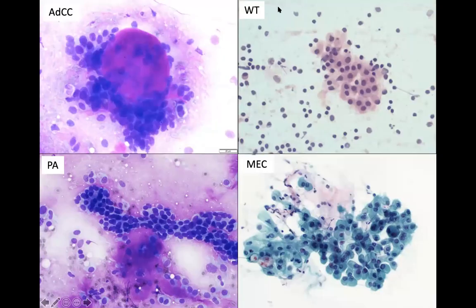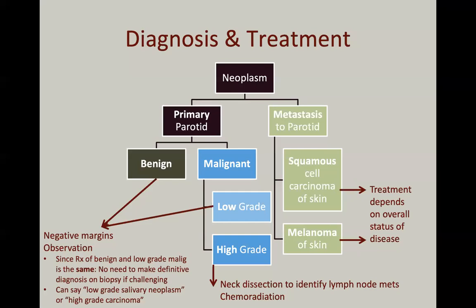Here are some examples of what might actually be diagnosable as neoplastic, ranging anywhere from adenoid cystic with this classic so-called bubblegum colloid. It looks like those old 1970s, 80s, like big chewing bubble gums. Also pleomorphic adenoma with these bland strips of cells and this kind of more fibrillary magenta matrix. There's Warthin tumor that is composed of both oncocytes and lymphocytes, and then mucoepidermoid carcinoma, which contains neoplastic cells containing mucin, as well as perhaps some extracellular mucin. So these are just examples of what we might see that could render a specific diagnosis on an FNA.